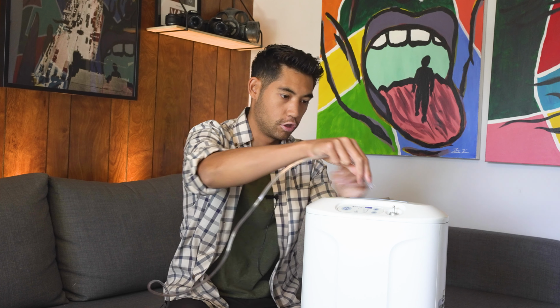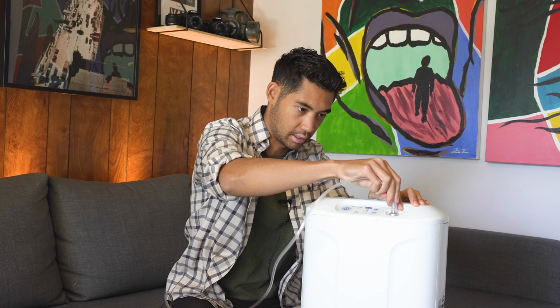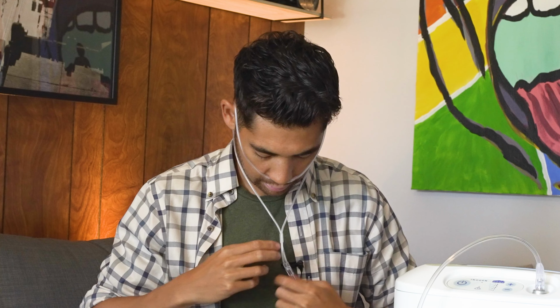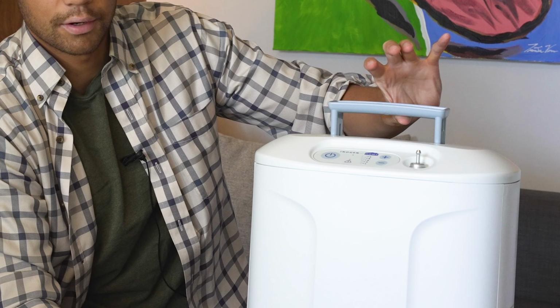So this barb here is just for your cannula tube. So you're gonna take the end of the tube and just push it slowly and gently, just like that. And there you go, it's nicely connected. So to put this on, you're just gonna put it underneath your nostrils like this, around your ears, and then you can tighten this up to wherever you feel the most comfortable. Okay, super simple.